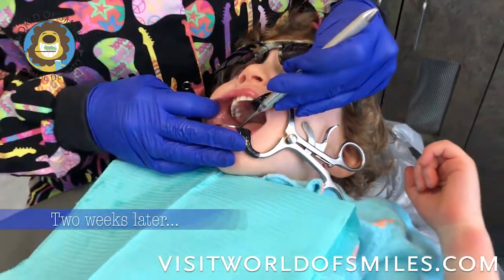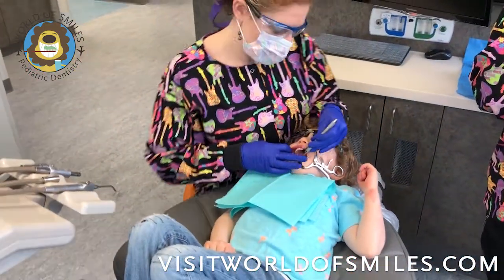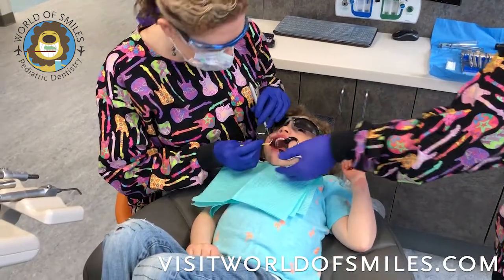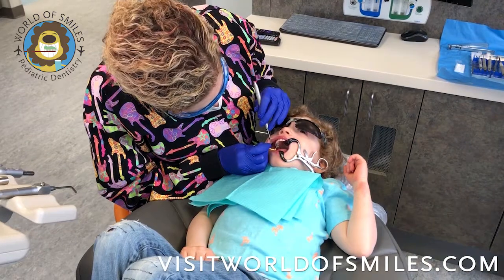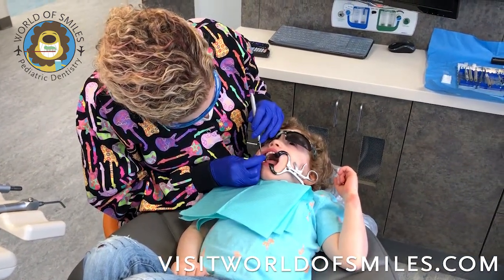Two weeks later, we'll come in and see that the silver diamine fluoride has worked and arrested the decay on those teeth. Now we will do the SMART technique. First, we go through with the etching process.